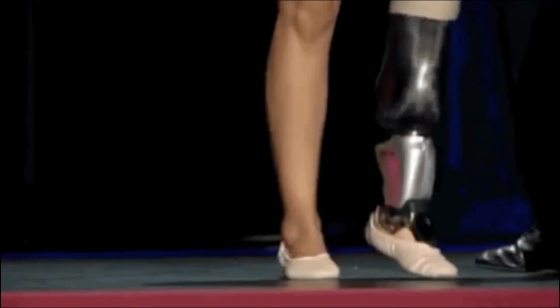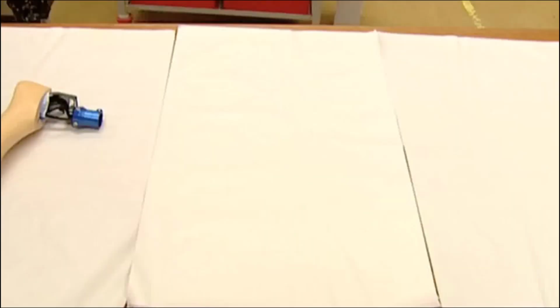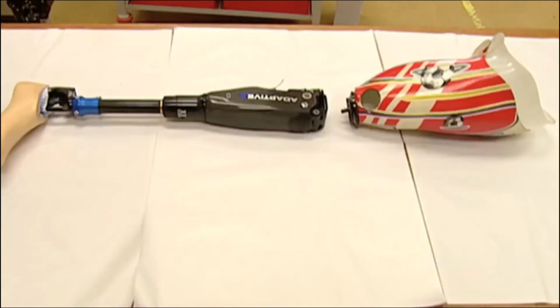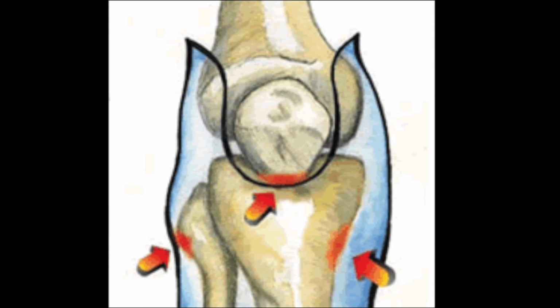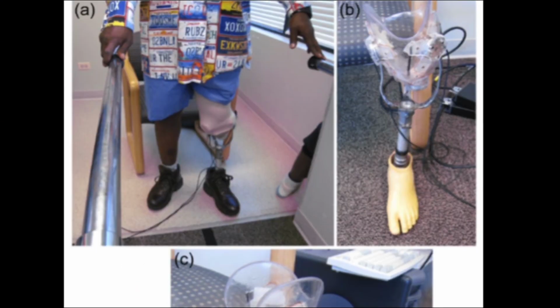Worldwide, approximately 10 million people live with limb loss. Many people with lower limb amputations use a prosthetic leg like this one. The key to a good socket is reducing pressure and shear on our bones, but current systems to measure these stresses are bulky and rigid.